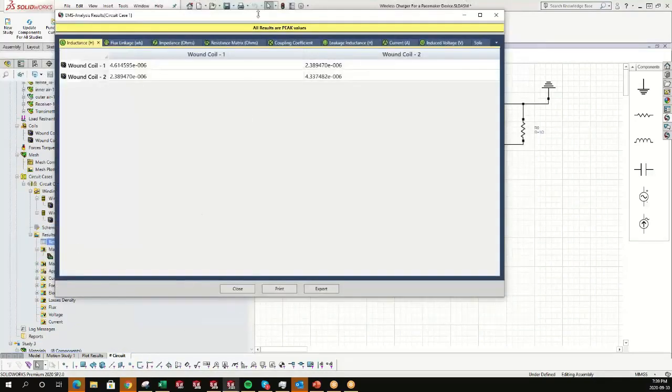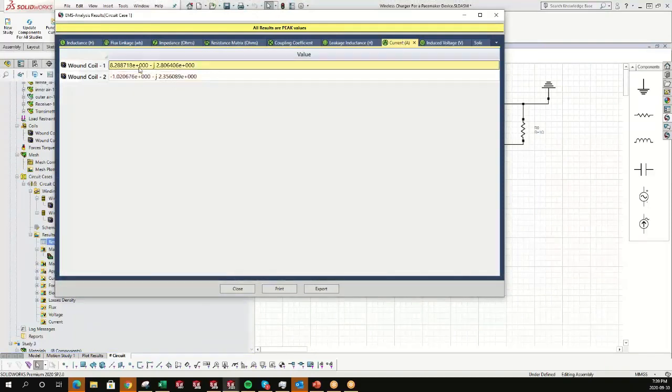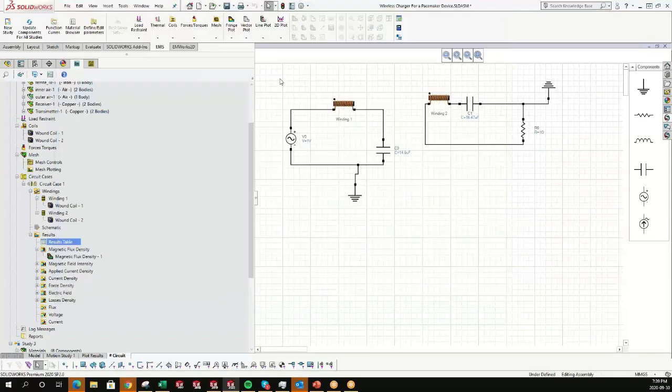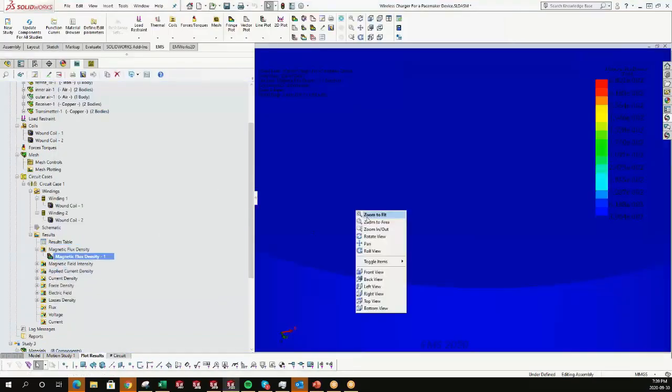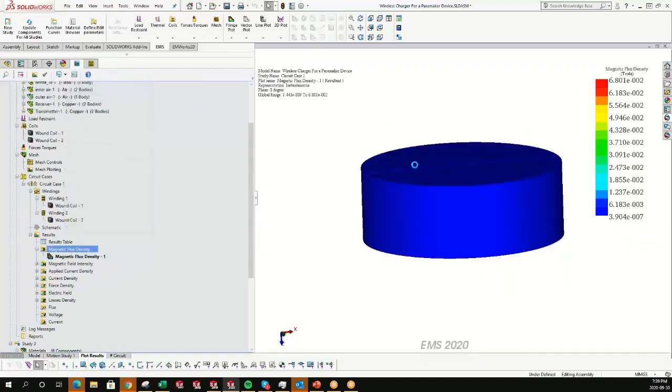You can check the results and see, for example, the current. So the input or transmitter current is around 8 amps peak value, and the receiver is around 2.3 amps. So this is at the resonance. You can see. Have a look at the vector.